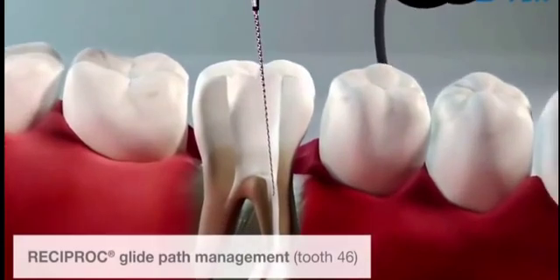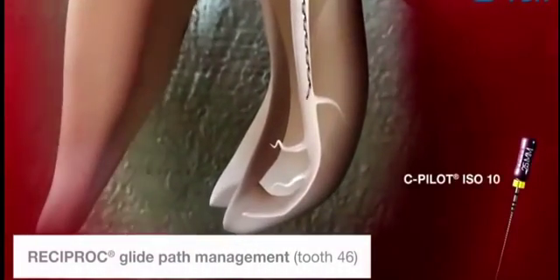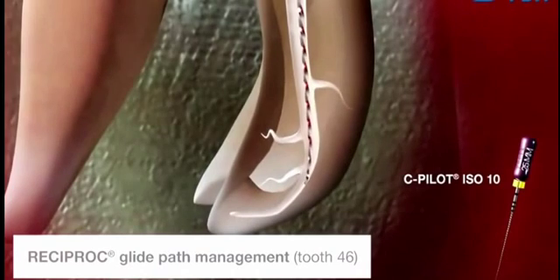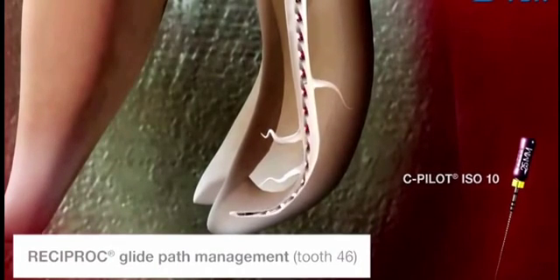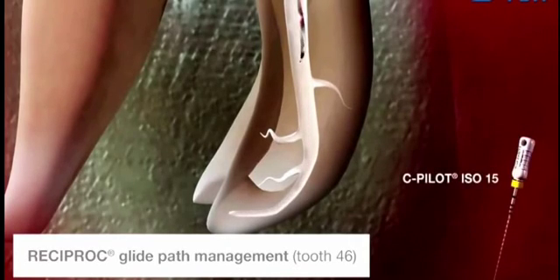In a few cases, it is possible that the ISO size 10 hand instrument can only reach working length if it is pre-curved. In this case, a glide path is created to ISO size 15. Following this, you can continue with the preparation.